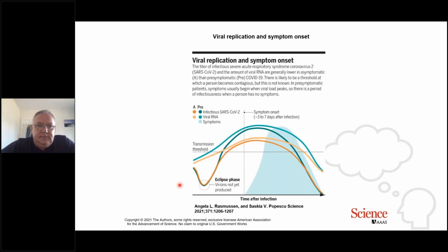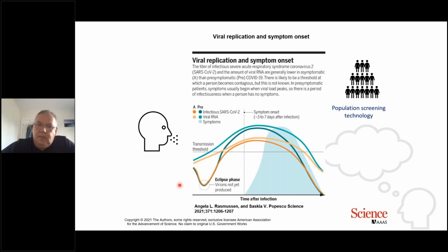So I'm coming back to why. Why do we want to do this? Why is MALDI-TOF going to prove to be important, or I believe it's going to prove to be important, in what we're going to be facing in pandemics and future biosecurity? The whole point is we want to do population screening of people without symptoms, to identify the asymptomatics who may spread the virus to others unknowingly, completely unwittingly, because that's how viruses spread.